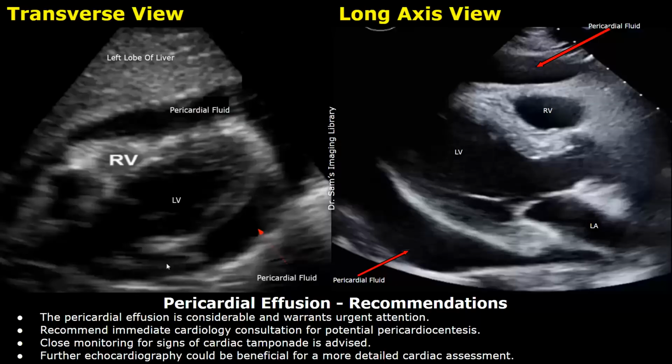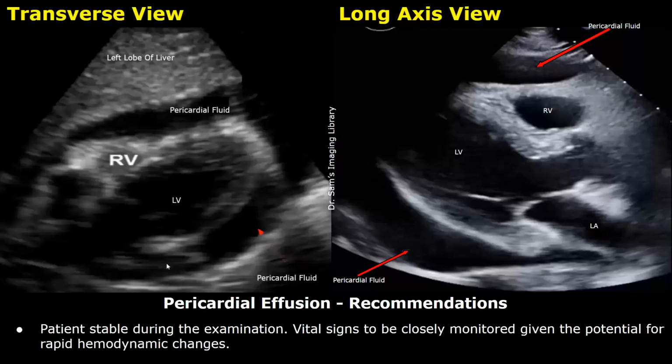Patient stable during the examination. Vital signs to be closely monitored given the potential for rapid hemodynamic changes.